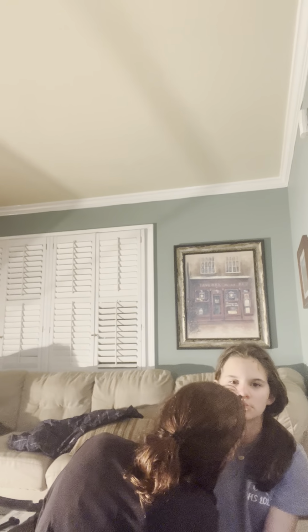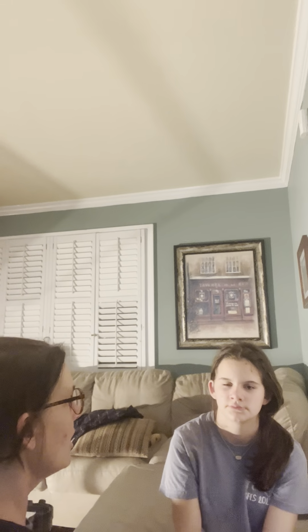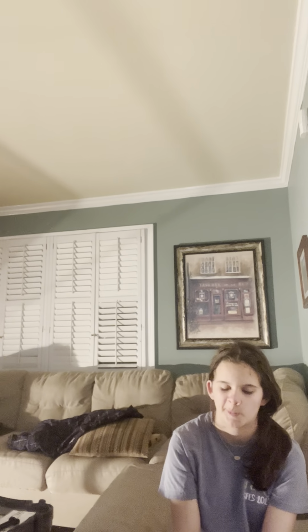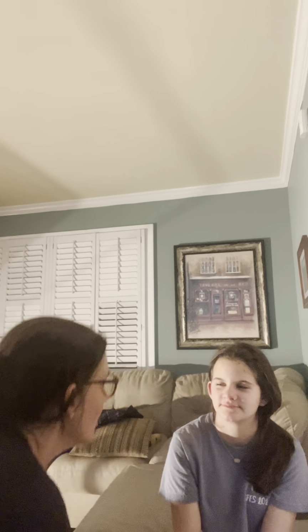And in here, I'm able to observe all of her nose, and it looks normal. I see no polyps, no excessive mucosa or secretions, no scrapes or scratches or anything in her nose. So her nose is normal.